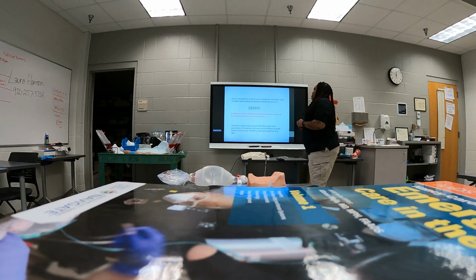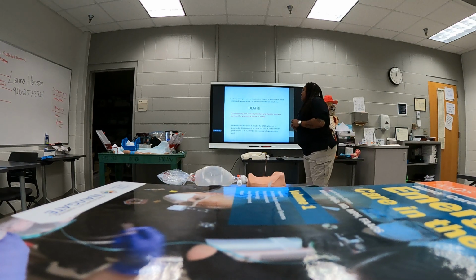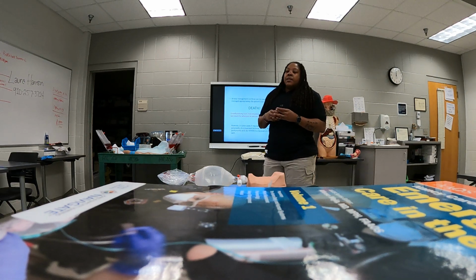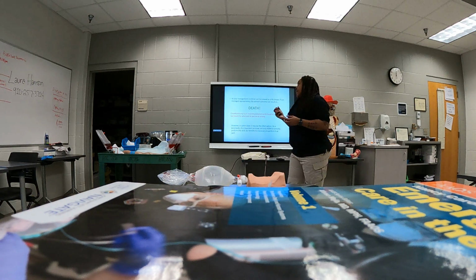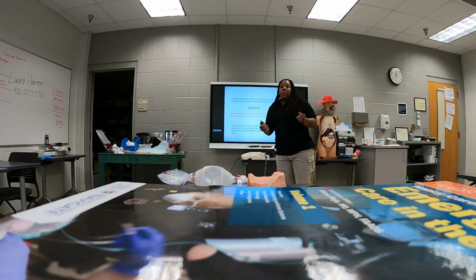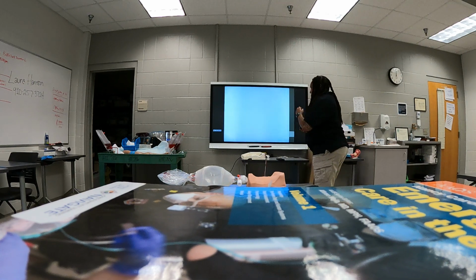Cricothyrotomy is an invasive procedure and should be used as a last resort for attempts to secure an airway. Just as I spoke on briefly, we have our BVM, so you have positive pressure ventilations, we have CPAP, we have other forms that might help a person breathe, but if a person absolutely needs this, then that means that their airway is imminent, and it's probably an obstruction of some sort. But like I said, we'll have a little fun, we'll get into it.